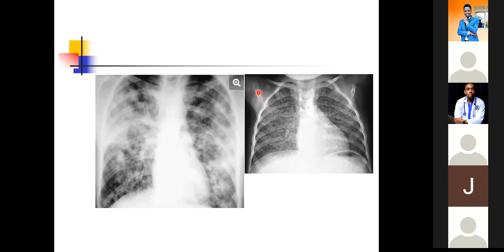So the first question relates to these pleural-based triangular opacities. Often we don't see it. If you happen to see it, then you have chanced on a classical patient. So that is the one strange thing with radiology.